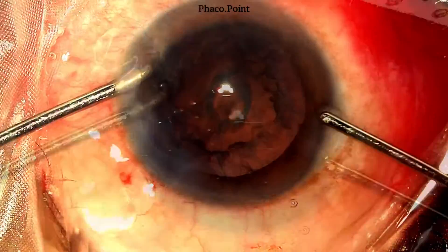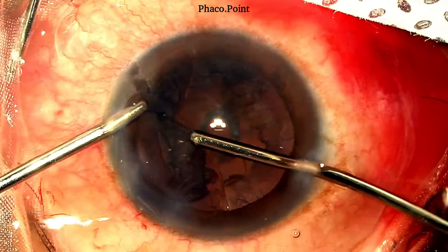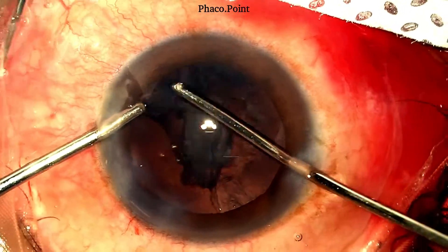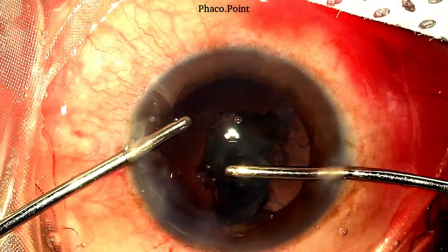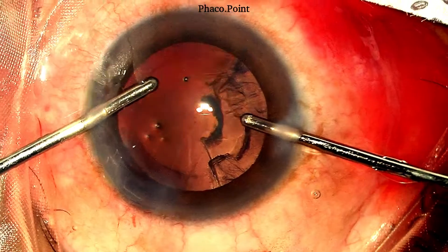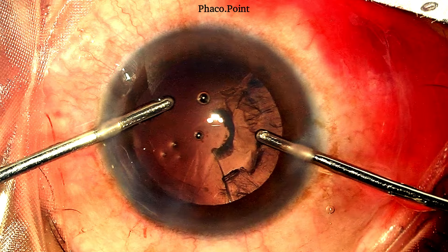The next step is bimanual irrigation aspiration. The left side of the cortex is first removed, following which a visco fluid exchange is performed, the hands swapped over, and then the right side of the cortex is removed. Upon removal of this last part of the cortex, there was a classic spindle-shaped tear of the polar cataract underlying it. Now let's see what steps we need to take having identified an open posterior capsule in this polar cataract.